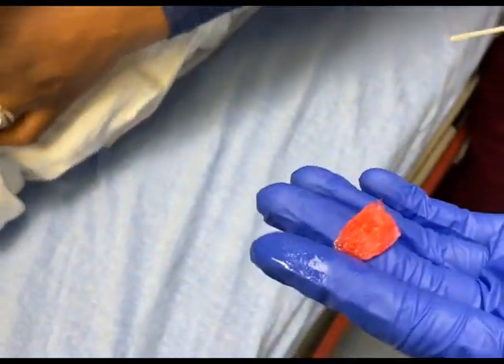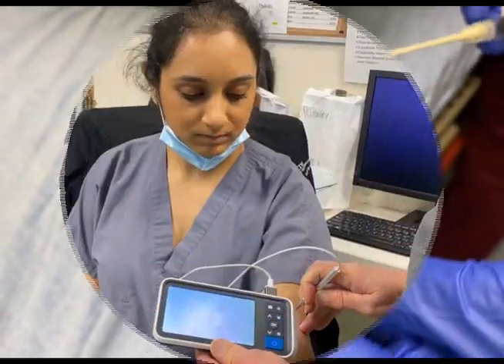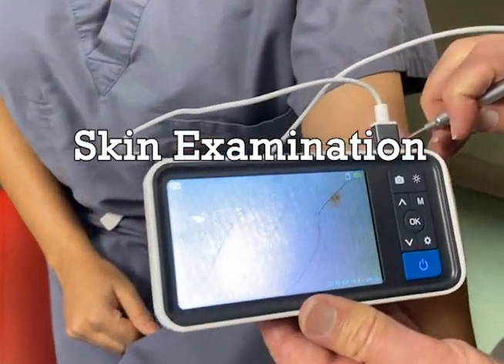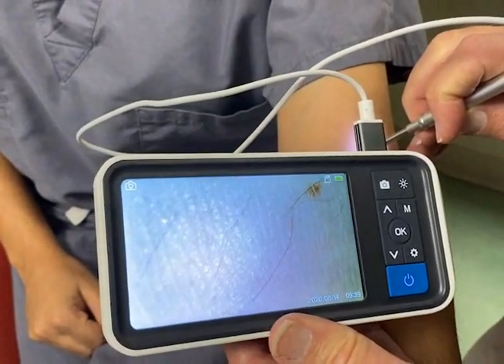Okay, let's see what we got there. Part of a pool noodle. That's it. All right. See how distinct that skin is? Look at that. And there's the mole. There's a hair. It really gets a good close-up on skin.